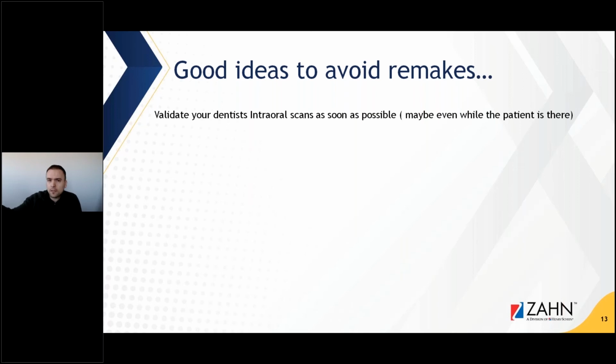And if you have the ability to either do it yourself as a lab, to quickly jump on TeamViewer or any other remote service onto your dentist's Trios or iTero, whatever they use, and to quickly see how that scan looks, or just have them send it to you and quickly take a look while the patient is still there, it will save you and the dentist a lot of time and money. And we find that doing that really helps. So whenever we receive our stuff, we try to jump on it right away, and it helps.